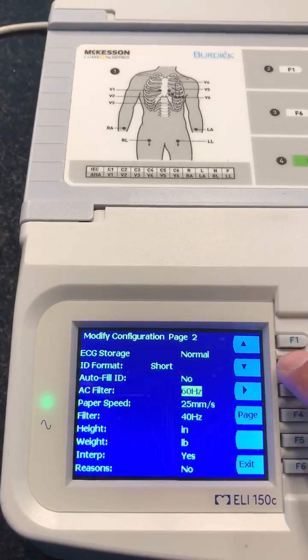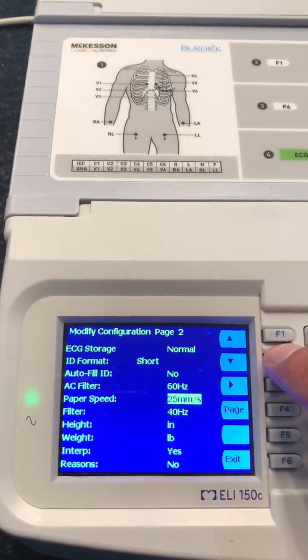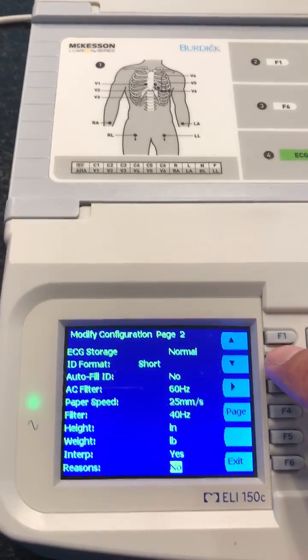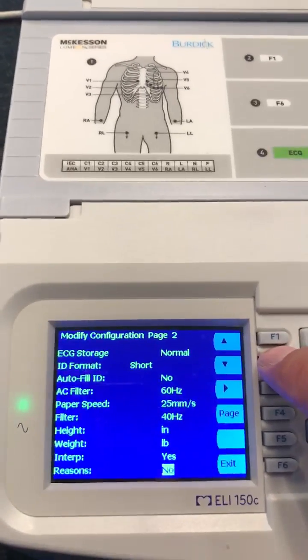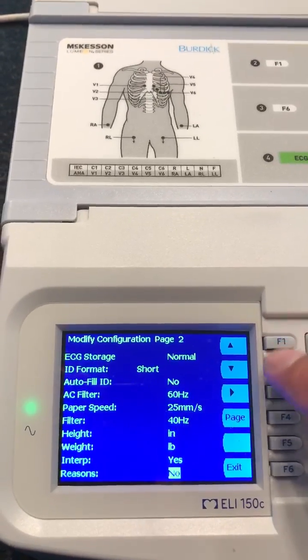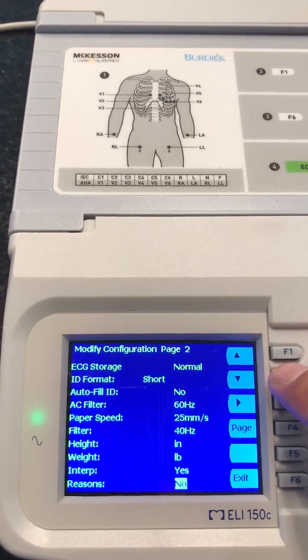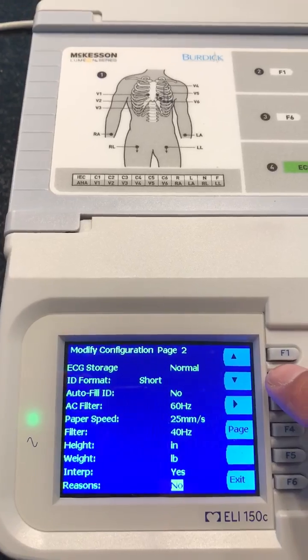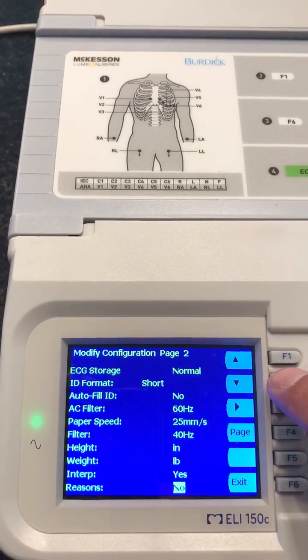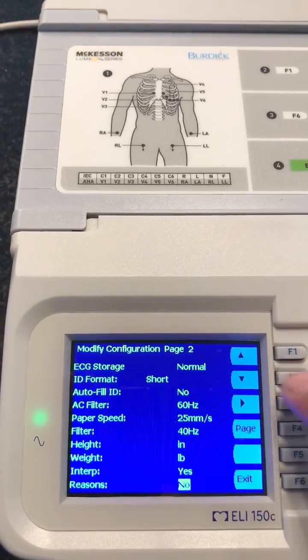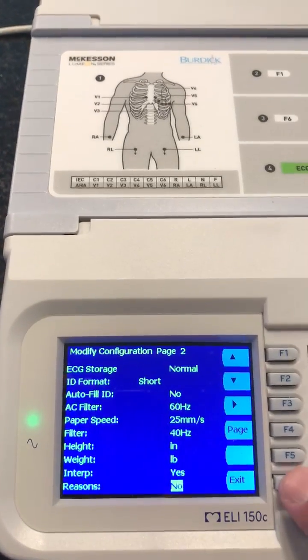From there I can scroll down through different parameters I want to change — things like setting up EKGs for best 10 or last 10 samples, changing the filters. Once done, hit the exit button.